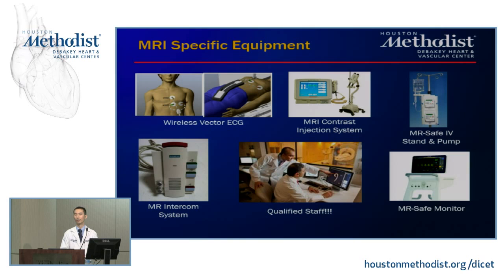You need fellows and attendings who are capable of looking out for different complications, and nurses to help administer the medications, place the IVs, and help monitor the patient. And I can't say enough about the technologists here. The technologists know very well how to set up the scan sequences, compensate for the cardiac rhythm, and adjust parameters as necessary. So very well-trained staff are extremely helpful.